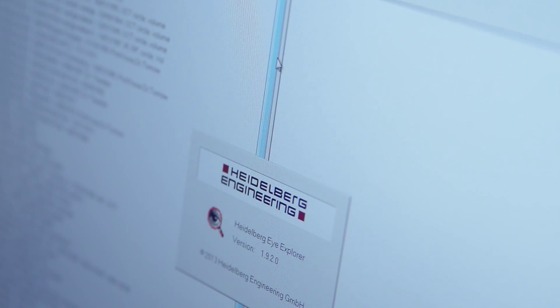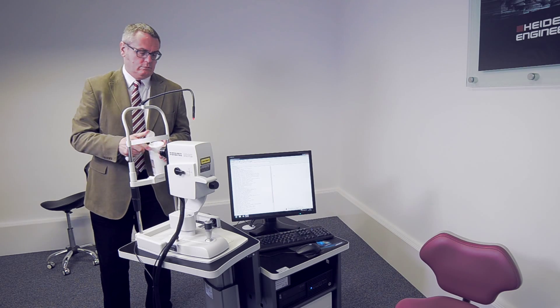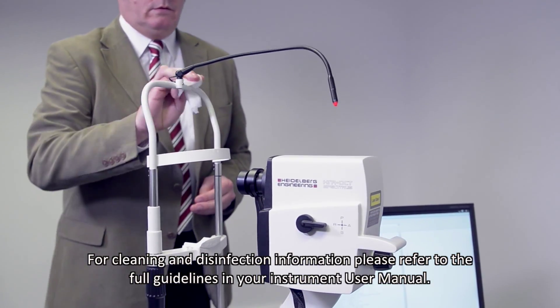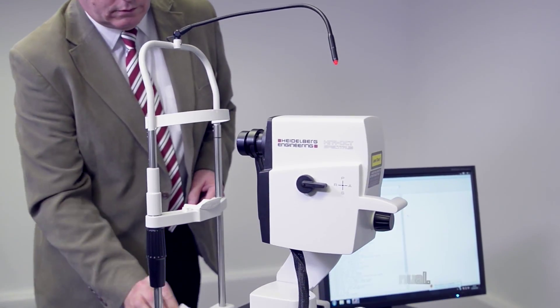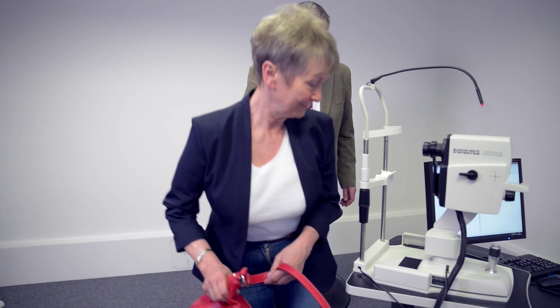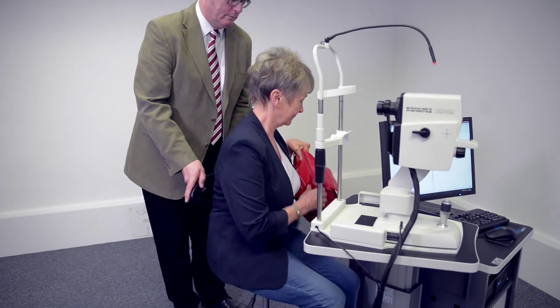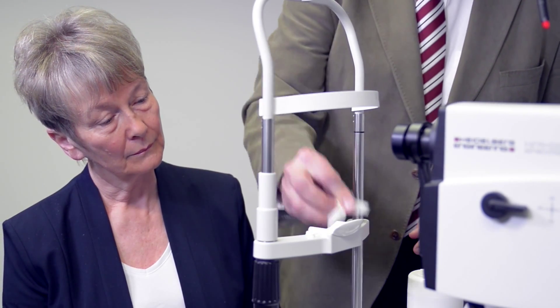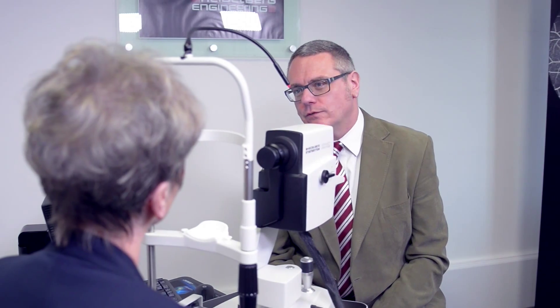Start Heidelberg Eye Explorer and clean the headrest in accordance with local infection control policy. Welcome your patient and seat them in front of the Spectralis instrument. Ensure the headrest is clean and explain the procedure to the patient.